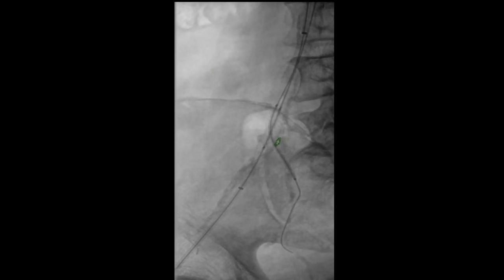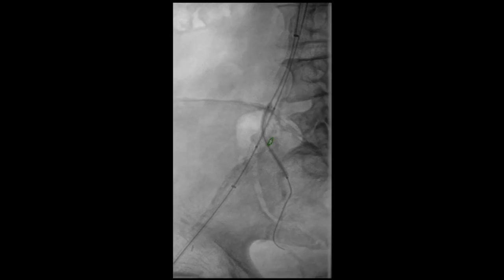The internal iliac stent has been positioned and the stabilizing VBX in the origin of the external iliac has been inflated. We then bring a separate VBX up through the external iliac stent, line it up flush with the internal iliac VBX, and both of these are brought up simultaneously. We also communicated with the anesthesiologist to keep an eye on the pressure. The vessels clearly accommodated both of these balloons being inflated simultaneously without any problem.